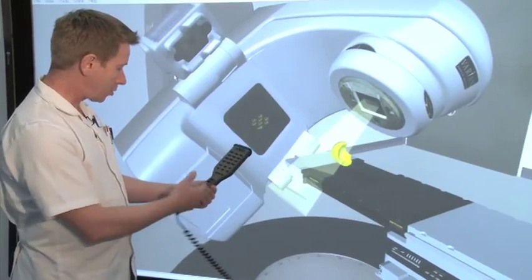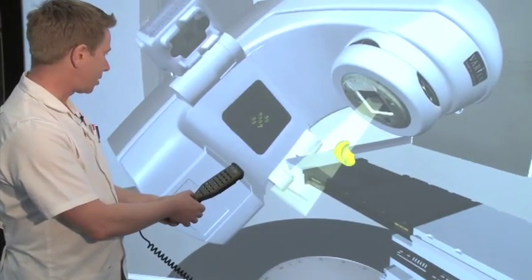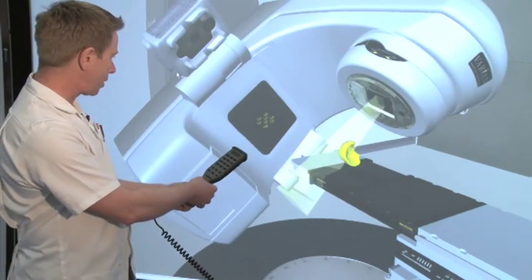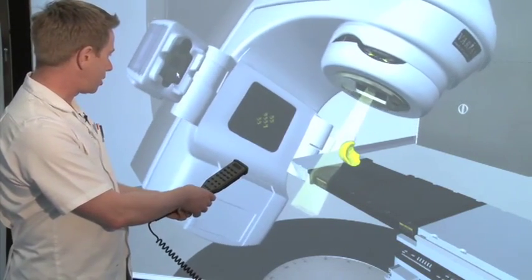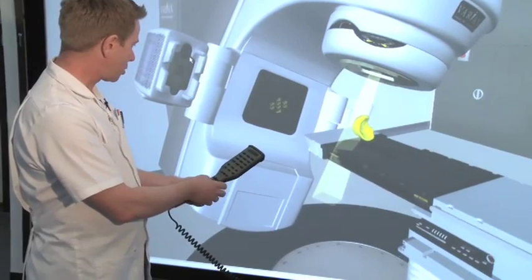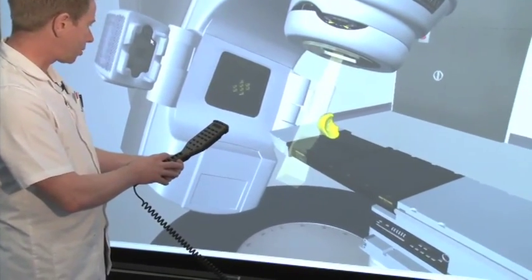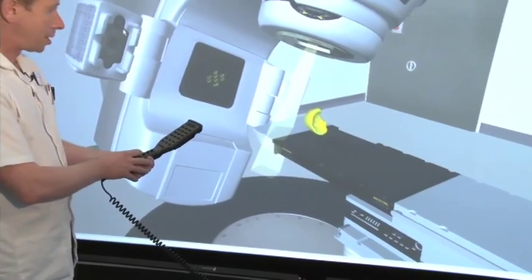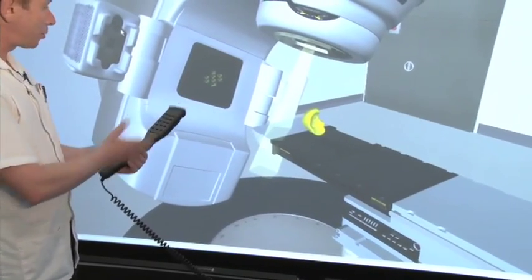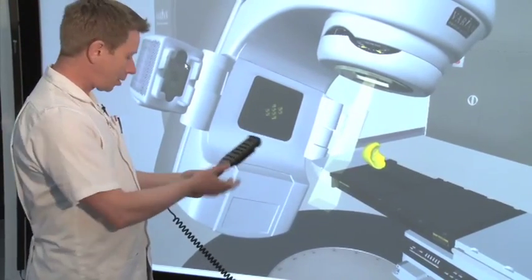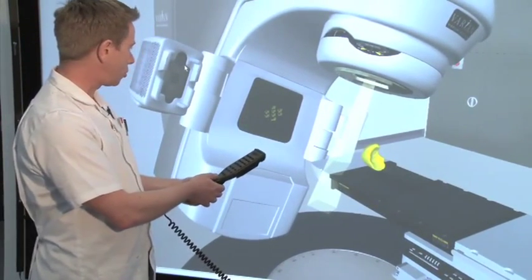The great thing about it is the hand control and everything on it is exactly the same as we'd be using in the clinical setting. So there I'm moving the collimators, I can move the gantry, I can move the couch and it's exactly the same as we would be using. So I can practice without fear of making a mistake without having a patient on the bed and it gives me time to make mistakes and be comfortable with using the controls.